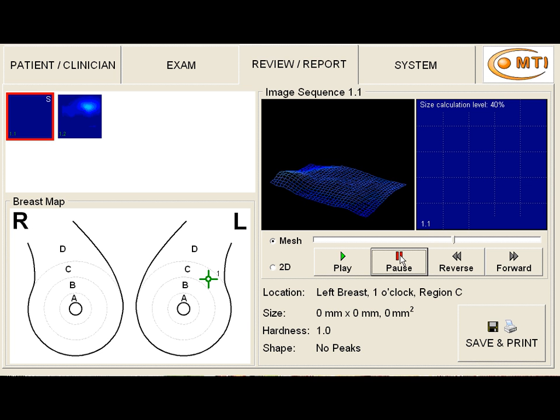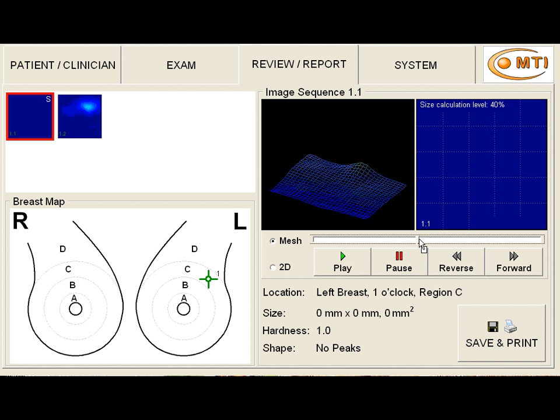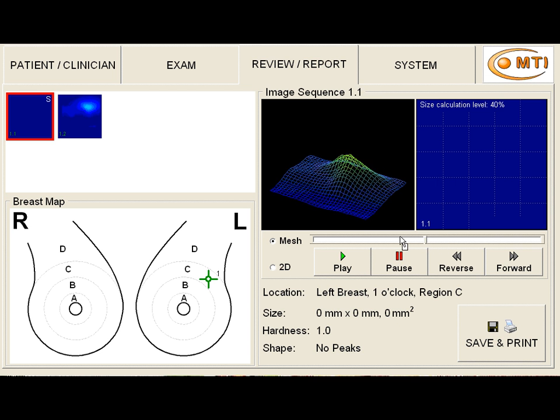And what that is, is the examiner, as they change directions, pushed down on the patient a little bit harder. And when they pushed down on the patient, they created this larger artifact.